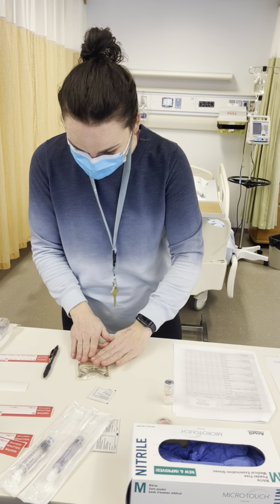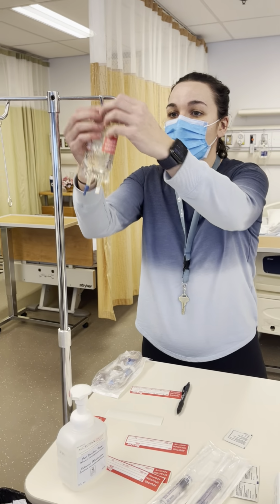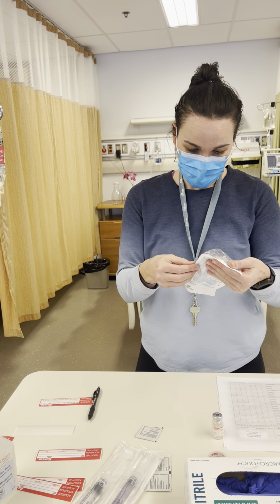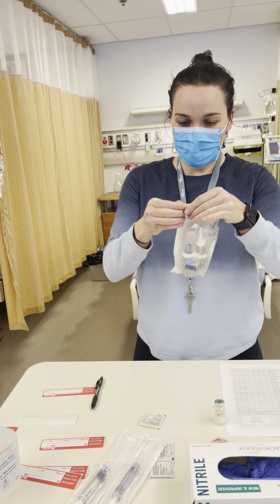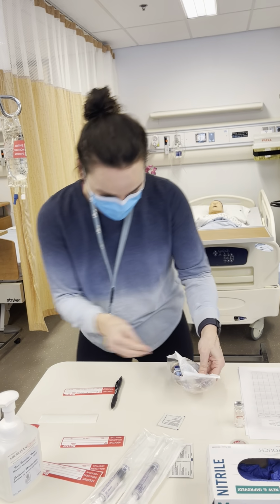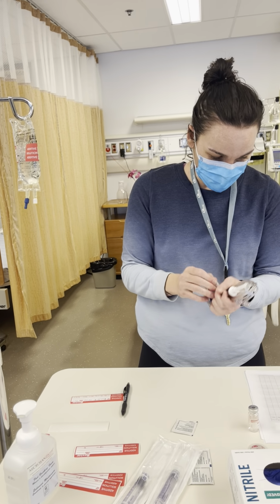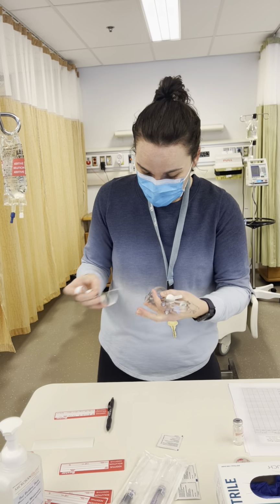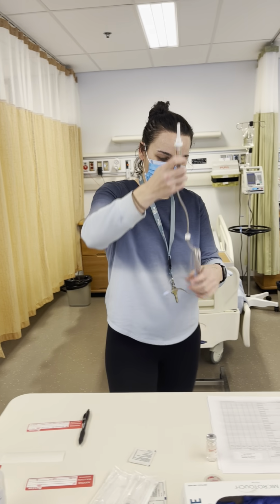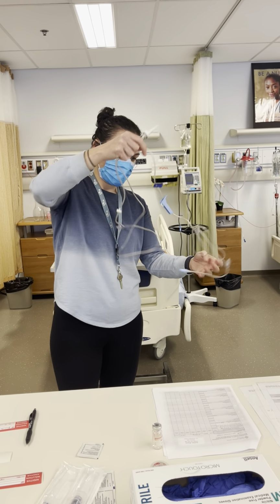Okay. Now we can go ahead and prime our line. This would normally be portless tubing, but we don't have any, so we're going to use this for the video. Remove all of this, and make sure all of our clamps are closed.